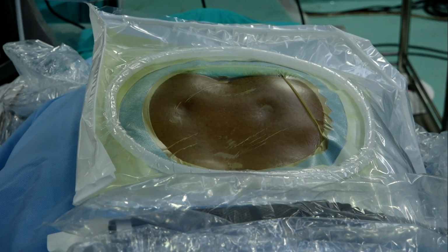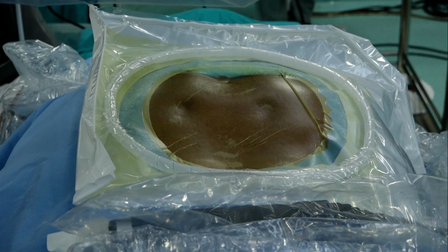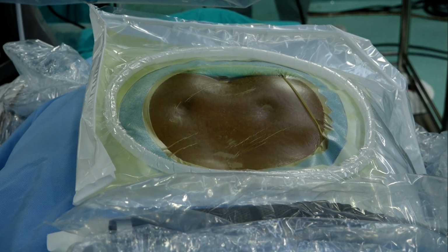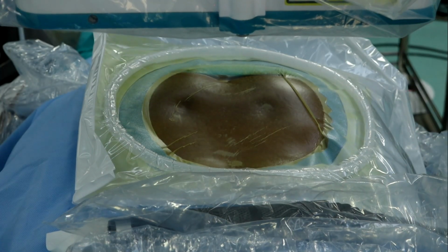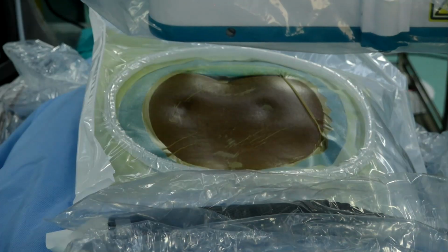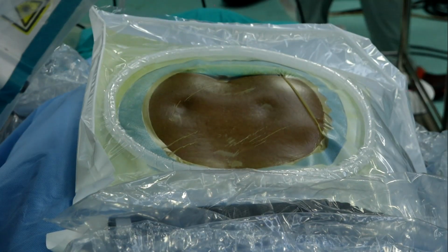Sometimes we might not know whether it is a lumbarization or sacralization. So how do we know what level we are operating on? Very simple. Look at your MRI, which is the last level of the disc that is there. From that disc, count upwards to the diseased disc, and on your fluoroscopy also look at the last disc, and based on that you will be able to target the diseased disc in the fluoroscopic image. So it's always good to have knowledge of lumbarization and sacralization.